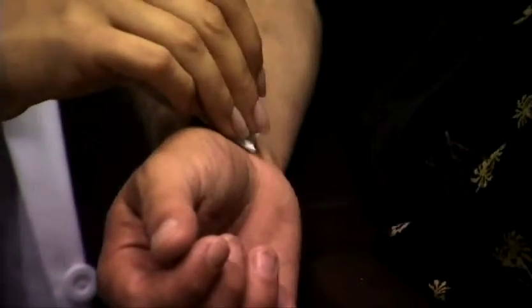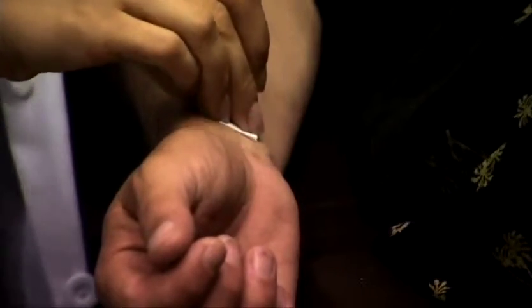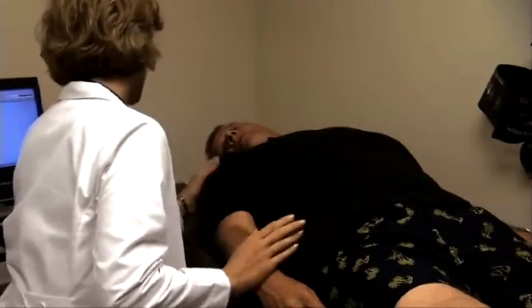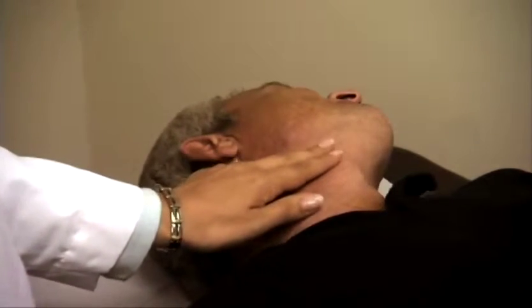Clean and, if needed, shave the skin in the areas of application to assure secure skin contact with the ECG pads. Palpate and mark the pulses that will be used in performing the pulse wave velocity test. To find the carotid pulse, tilt the subject's head backwards and away from you, and use the tips of your fingers to locate the strongest pulse. Mark this location with a felt pen.